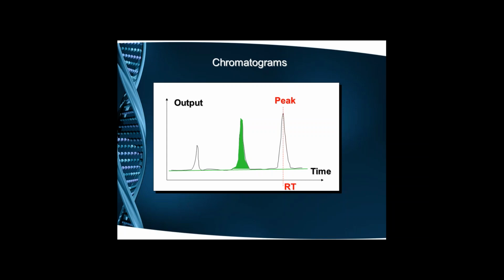Now once we have identified the hemoglobin, the amount of the hemoglobin present is calculated by the area under the curve. That is the area that's shown in the greenish shade. The area under the one in the greenish shade is divided by all the three areas and gives us the percentage of hemoglobin that is present. So what we get in this chromatogram is the relative percent of hemoglobin present out of the whole. Say out of 100%, we can see roughly there are three hemoglobins. So one would be 40, 40, 20, or so on, as it is given in the chromatogram that we see. Next.